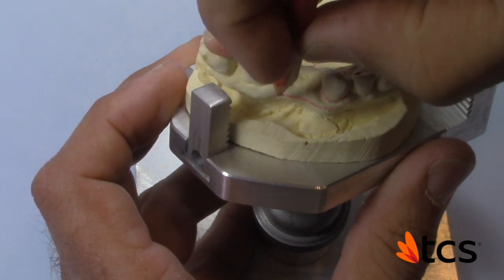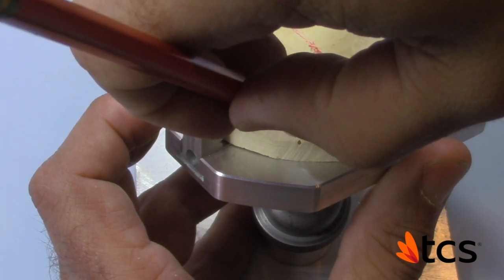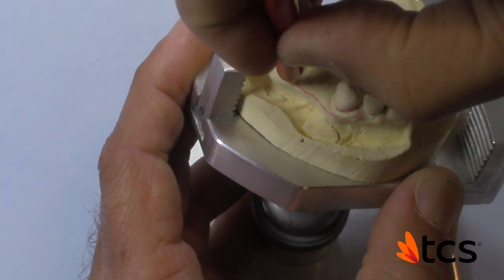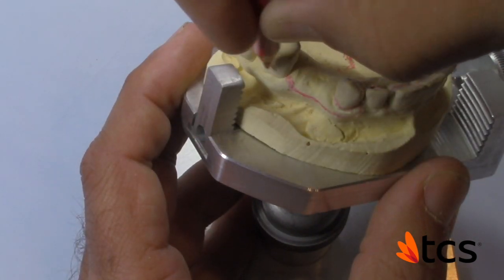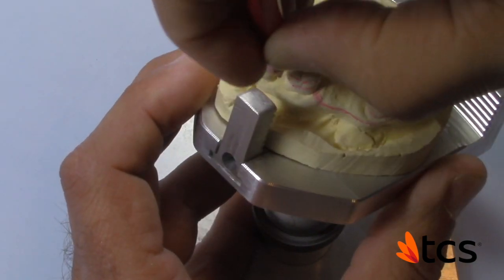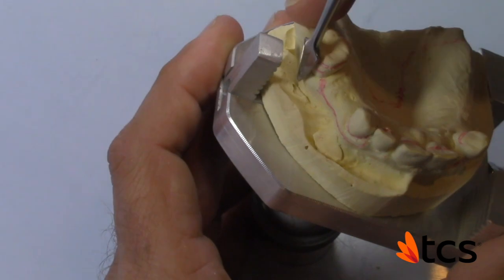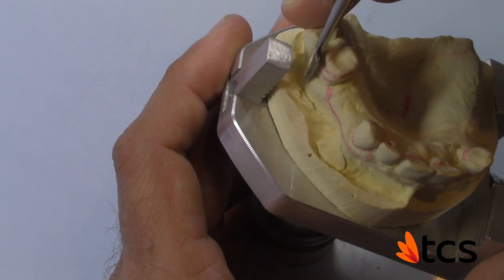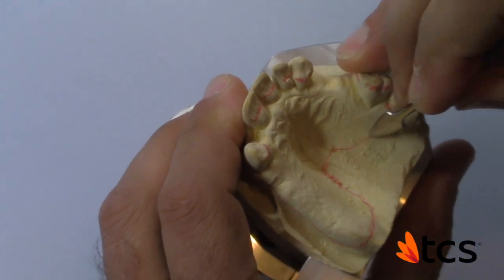The one thing that you don't want to do is pass the undercut with the material. This is going to be very painful and the amount of adjustment is going to be endless just because the buckle fold was incorporated in the plastic. So you don't want to do that. We're going to put a high finger clasp on the smaller — we're not concerned with aesthetics here. We're trying to avoid any tissue involvement, and even our path of insertion is going to be compromised if we go into the tissue area. So just trying to simplify things. Now we have to implement a palatal seal.